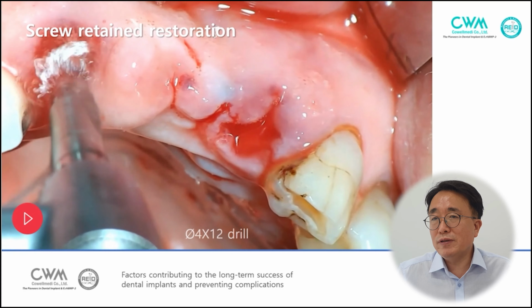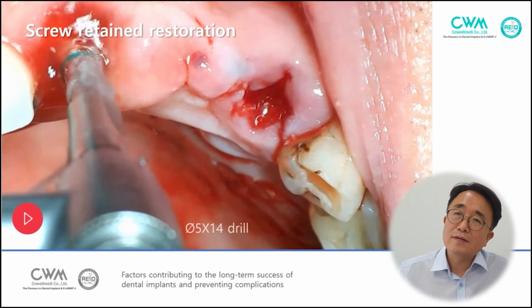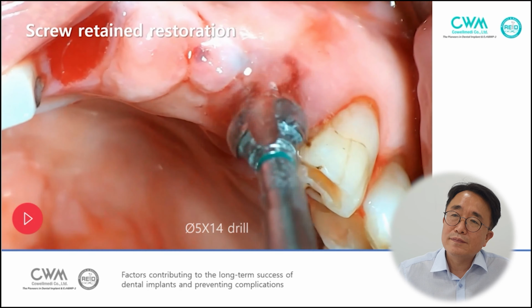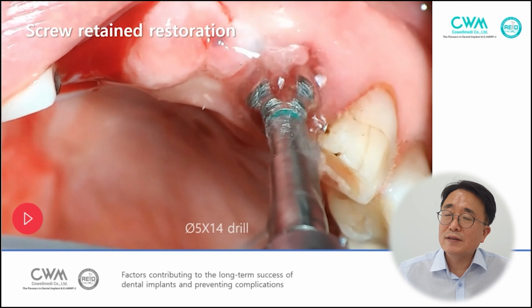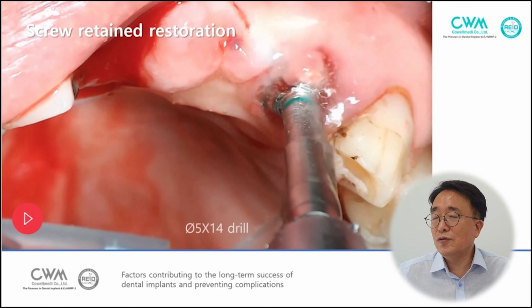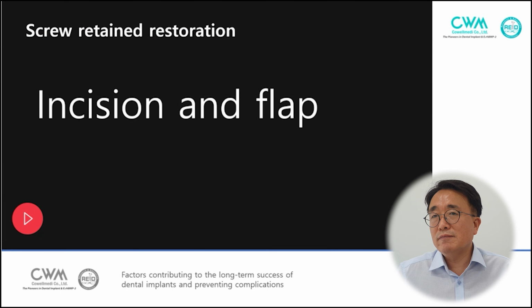If acute infection, you cannot control the bleeding. And finally, a diameter 5 drill was penetrated into the palatal wall, and incision and flap.